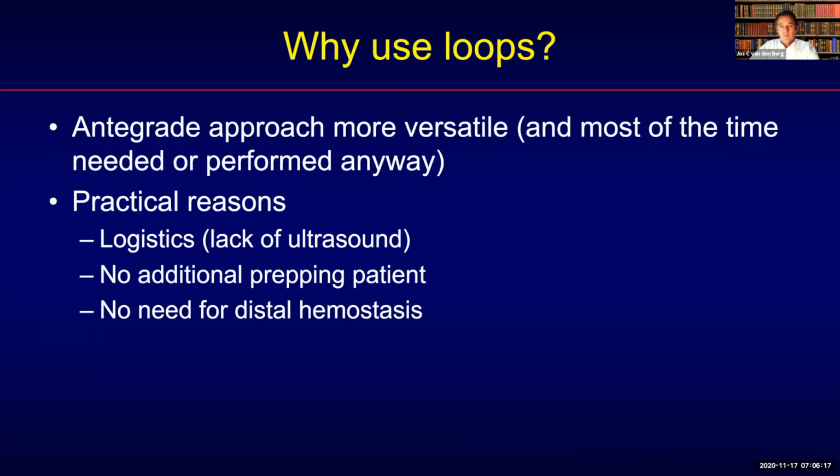I think a lot of people currently are doing retrograde sticks, but you may already have started with your procedure with an antegrade approach, and the antegrade approach is much more versatile. You can use much more material, larger bore sizes of your devices, and most of the time you already have that performed anyway, or it's needed. Then there may be some practical reasons, logistics.